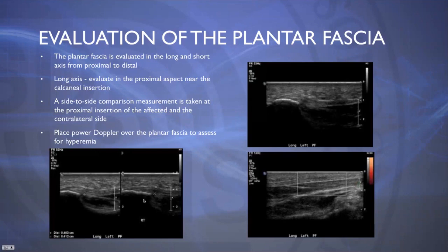We can place power Doppler over the plantar fascia to assess for any hyperemia, and in all of these images, these are all showing nice normal examples of the plantar fascia. It's not overly thickened.